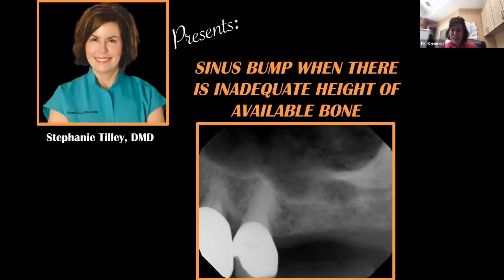Hello, everyone. Hope everyone's doing well today. We'll go through this quickly because I know time's of the essence. We're going to discuss, in this case presentation, a simple sinus bump procedure where there's an inadequate height of available bone for dental implant placement.